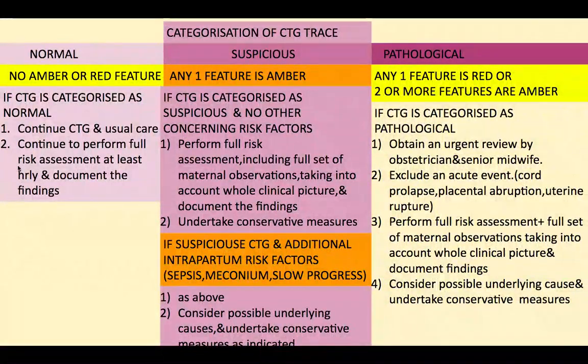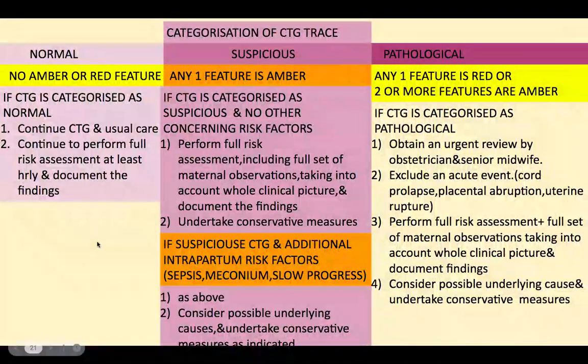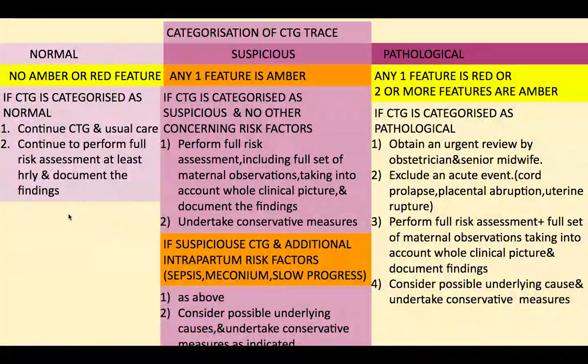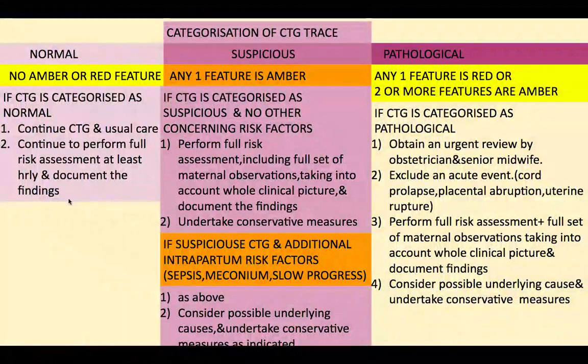Now this thing has also changed. Many candidates and many students are choosing the option where there is written 2 hourly assessment, 4 hourly assessment. Let me tell you that 4 hourly and 2 hourly assessment is not for the CTG. That is the intrapartum assessment of the vaginal examination. It has nothing to do with the CTG. This guideline has told that hourly assessment will be done, even if everything is going fine. Even if the patient is pretty normal, still you have to do the full risk assessment every hour and then document the findings.